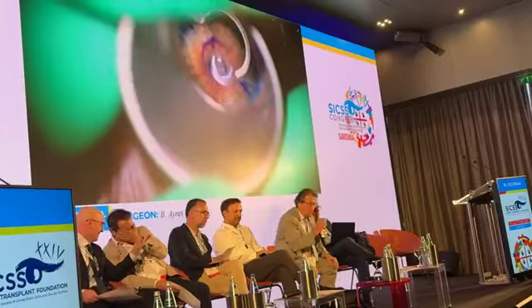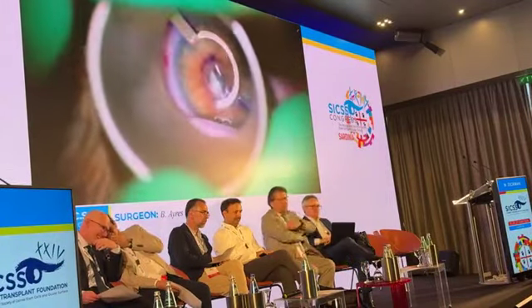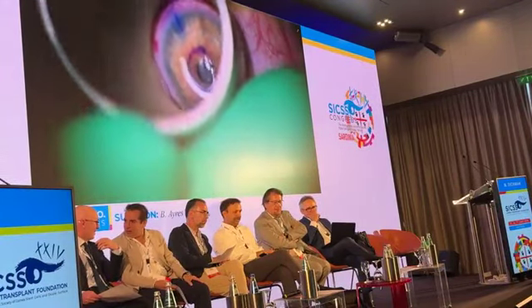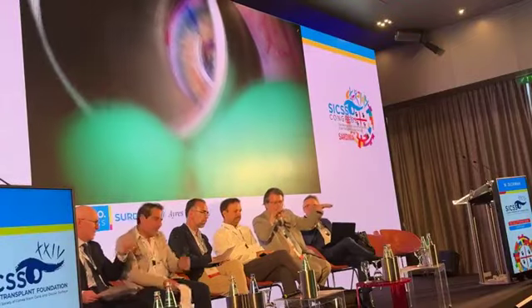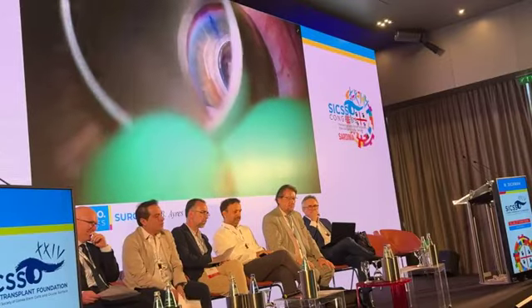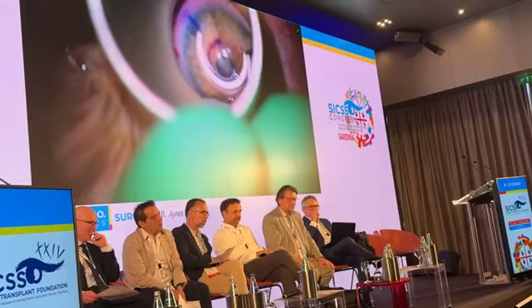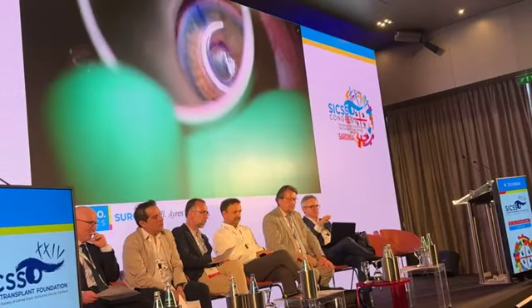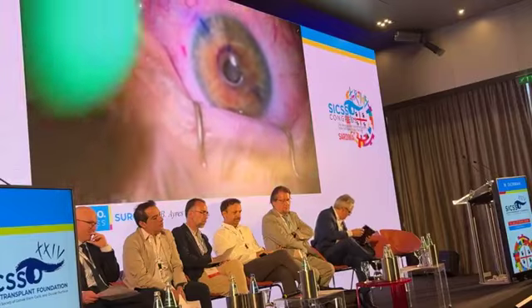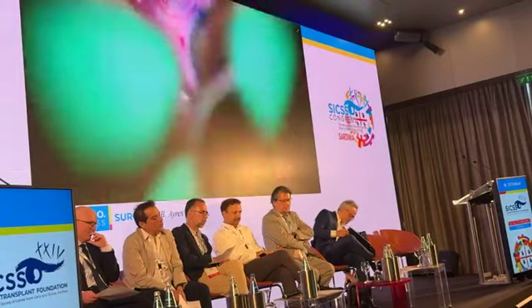Good. Once we get the channel started, we're going to go ahead and dissect. Here we're going clockwise. The CTAC segment here is relatively thick and large, so this dissector is a little bit thin. I like to wiggle a little as we enter the channel to make sure it's fully open. We're also making sure we're never pointing the dissector up. These channels are made at 200 microns of depth, and we want to make sure we never come up through the cornea. That would cause some issues. We'll dissect the other direction.